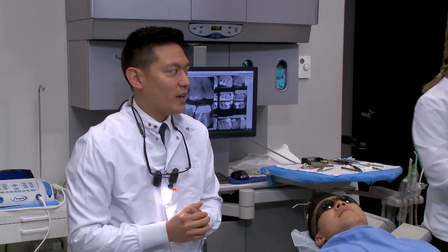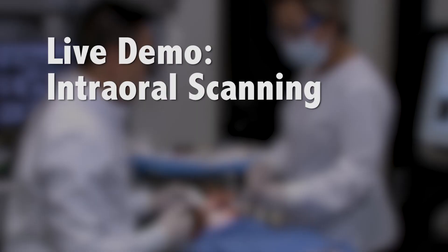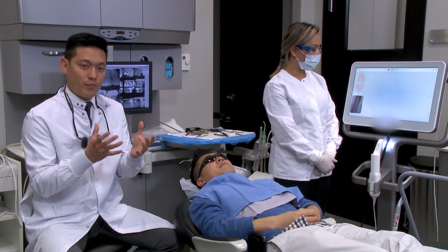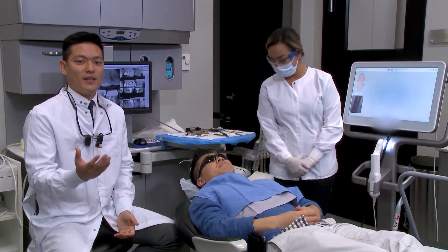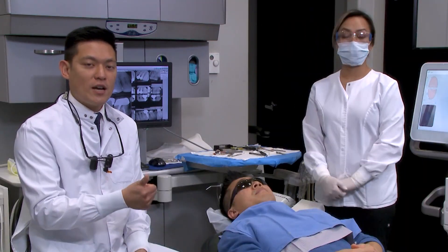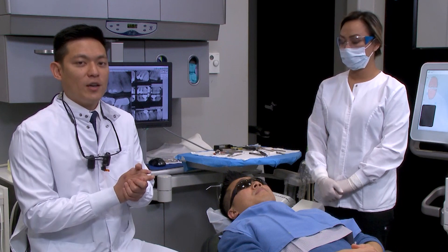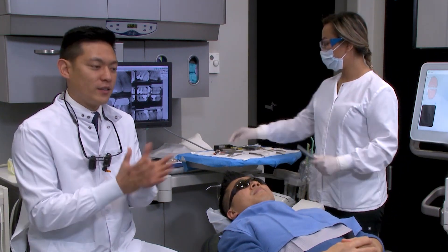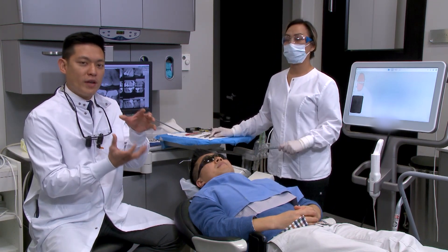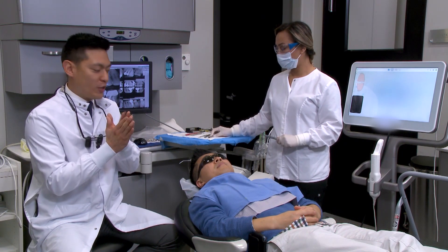We're going to jump over to the iTero now and I'll show you the setting up of the prescription. The digital impression is kind of like a digital triple tray — you're going to pick up the preparation and the quadrant the preparation is on. In this case, we're going to get prep 30 first. The iTero scanner gets a higher-resolution scan of the preps. Then we'll capture the rest of the adjacent teeth — I like to go all the way up to the canine — and then the opposing. From there we bring those two models together with a bite scan with the patient biting fully in centric.